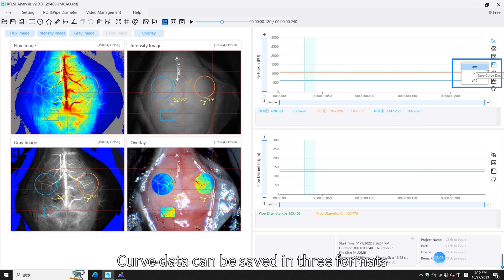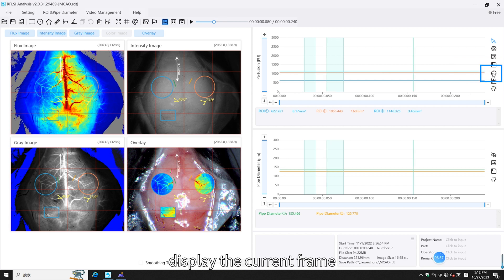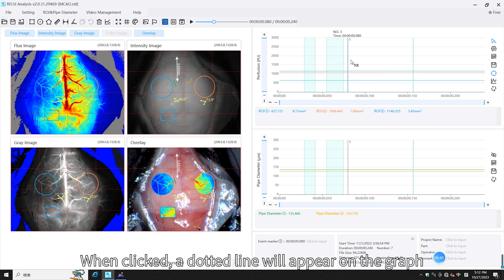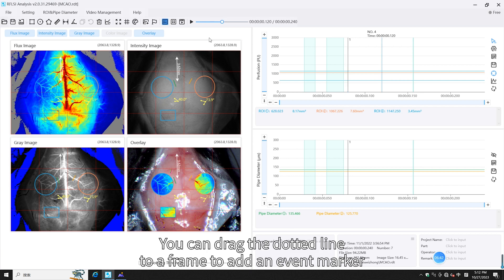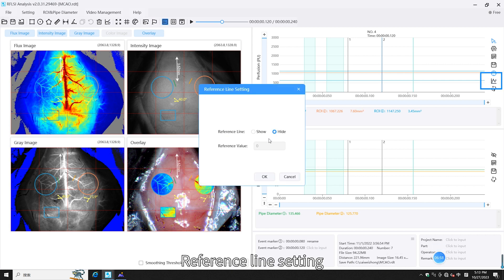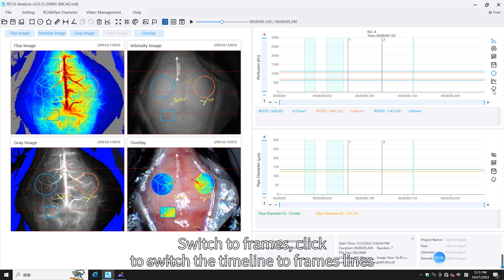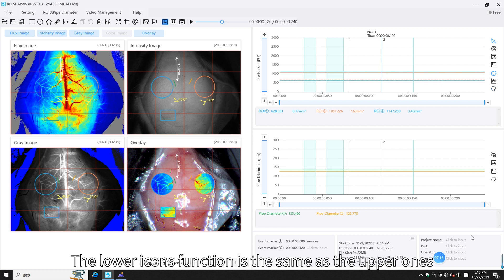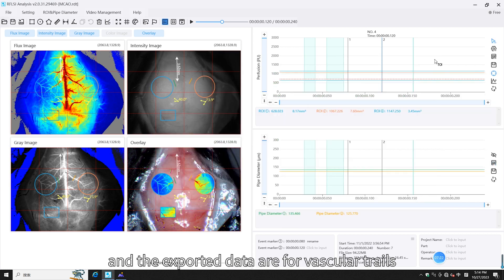Curve data can be saved in three formats: data in text format, data in table format, and data in image format. Clicking Display Current Frame will show a dotted line on the graph with the current frame and time point displayed at the top. You can drag the dotted line to a frame to add an event marker and modify the name of the marker. Reference line setting allows you to set the reference line for the perfusion volume. You can also switch the timeline to frames.